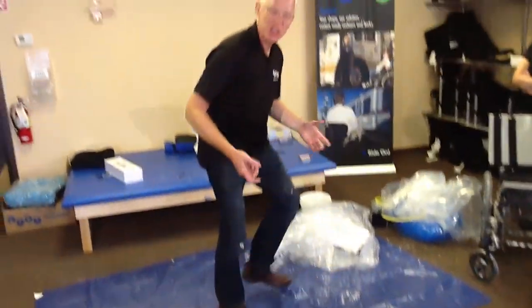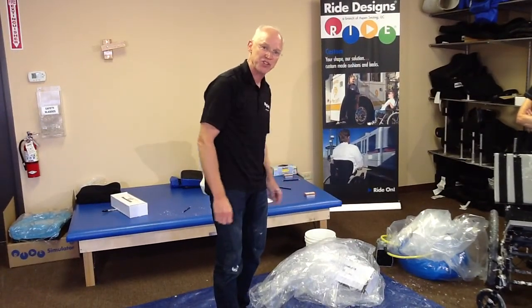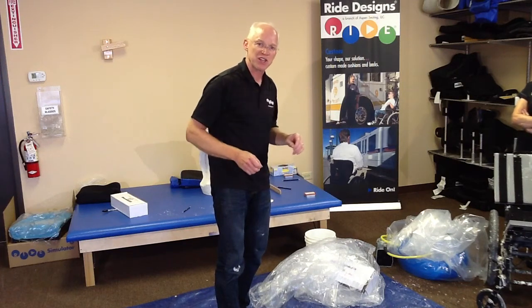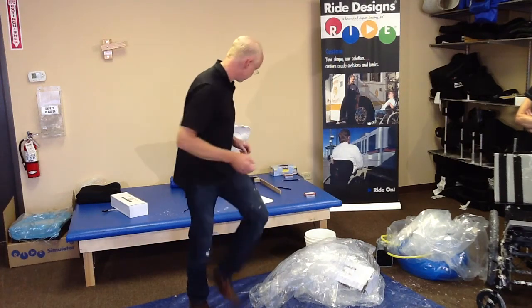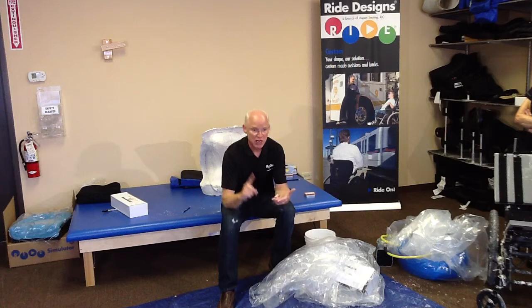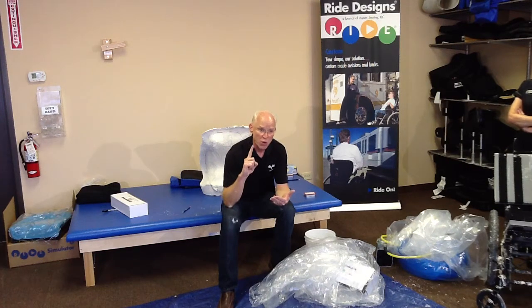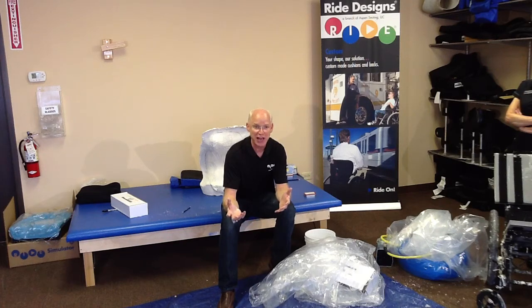The beauty of the ride simulation is everybody gets a clean simulation. Everybody starts with a clean seat simulator and a clean back simulator, so there's no risk of infection and things like this being spread from client to client. So, main points I want to drive home is beginning with a good mat assessment, development of a good seating strategy, execution of that seating strategy in the simulation, remembering that that first simulation should be considered part of the evaluation. We got it on the first shot. We got lucky, and I'm also familiar with Jenn. But had we not got the result we wanted, just refresh the simulator, loosen the bag, and try again.